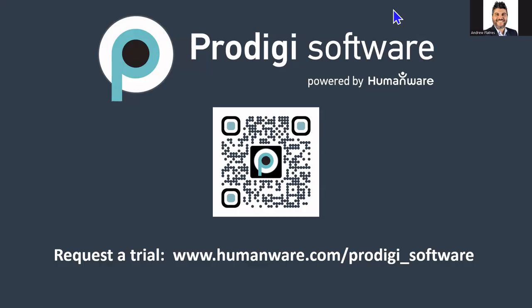I see one that came in through the Q&A tool, so let me open that up. Okay, so there's a question here. I don't know if you're seeing that on screen, but will there be a feature to annotate onto a captured image, e.g. for a school student's worksheet?